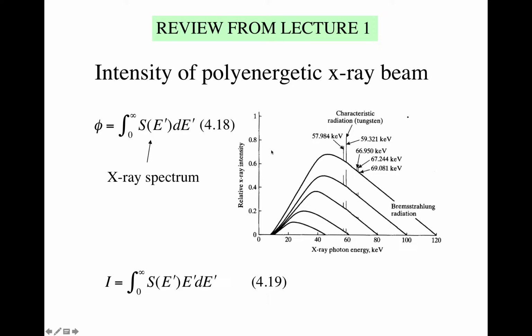What happens is as the X-rays exit the target material itself, the target material will absorb some of them, right? The lower energy X-rays, and the glass on the outside of the vacuum tube will absorb some of them, and then you actually put a filter, a very thin film of copper or aluminum or something, to also filter out lower energy X-rays so they don't hit the patient. So you wind up with something that looks like this.